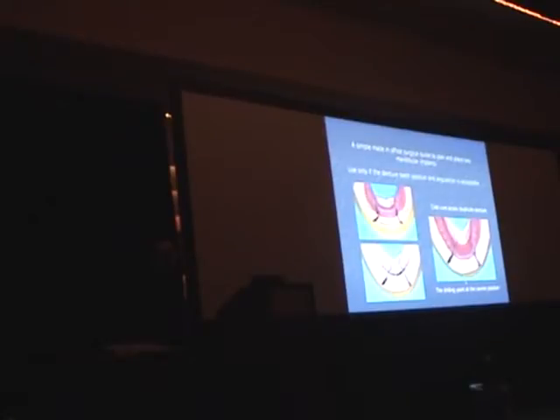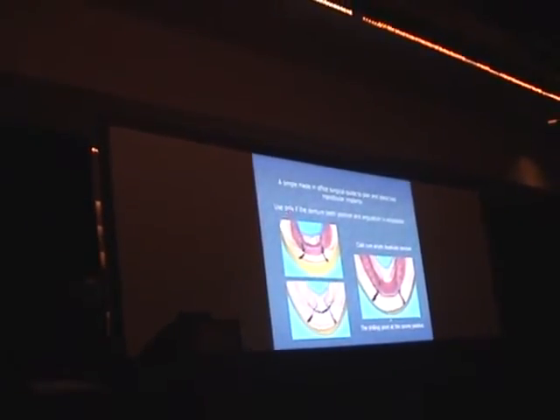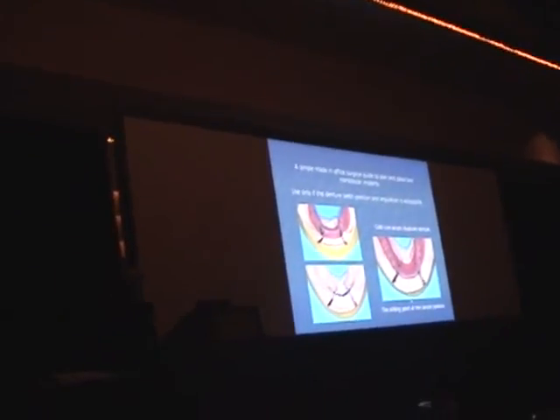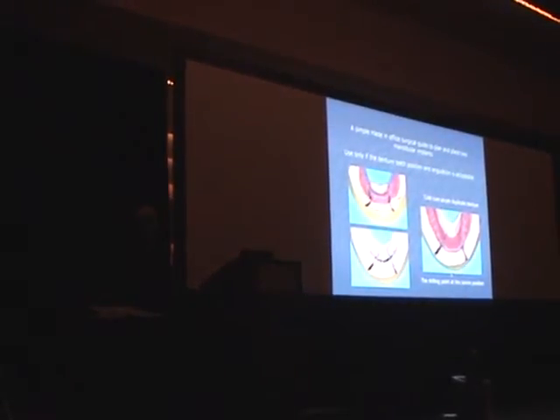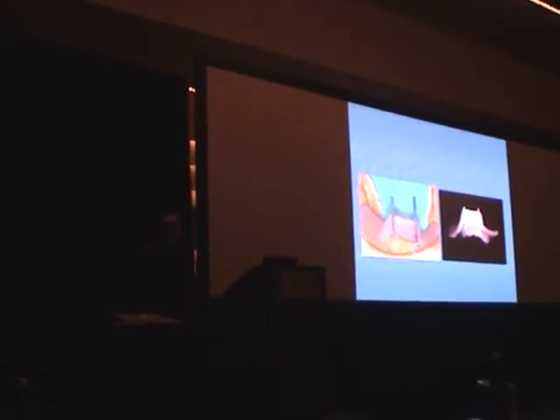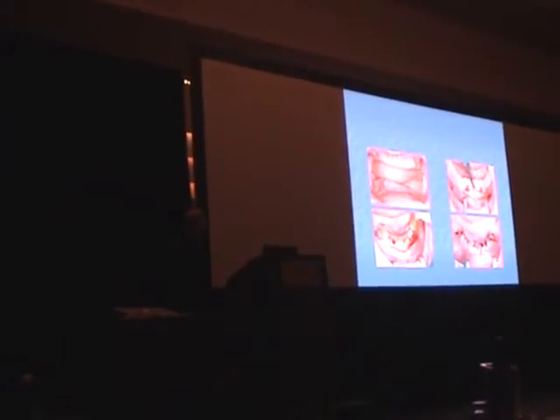A simple made-in-office surgical guide to plan and place 2 mandibular implants. I just duplicate the patient's existing denture. Use this procedure only if the denture teeth position and angulation are acceptable, and draw the lines through the canine position and top crestal position, and here you will get the drilling point at the canine position. But I don't convert this into a surgical guide. Sometimes I'm comfortable with using this kind of surgical guide, and when you drill, about 9 to 10 millimeter drill will go into the bone with this type of surgical guide.